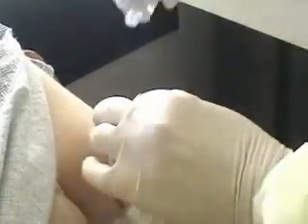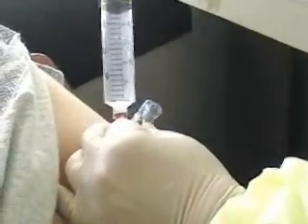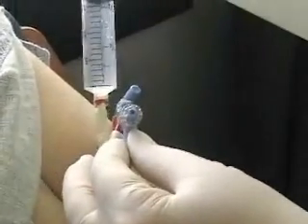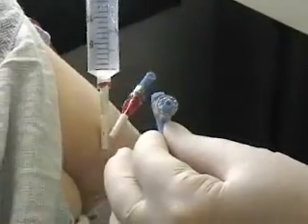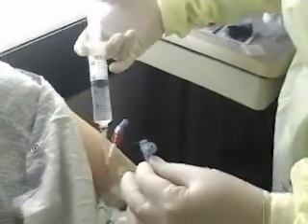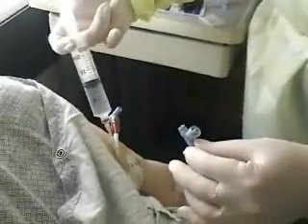Did you get your blood? I did. Got our sample. Now we're going to flush with 20 cc's of normal saline. You just kind of want to flush and then stop, and then flush and then stop — that clears out the PICC line better.